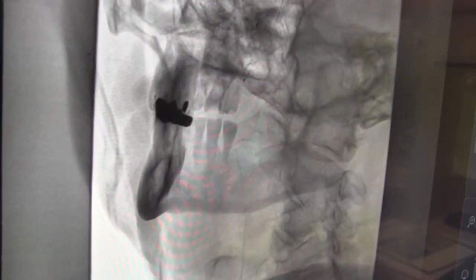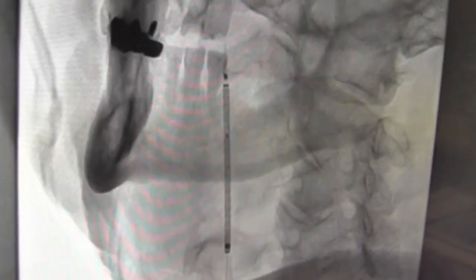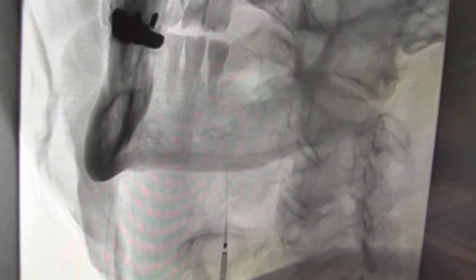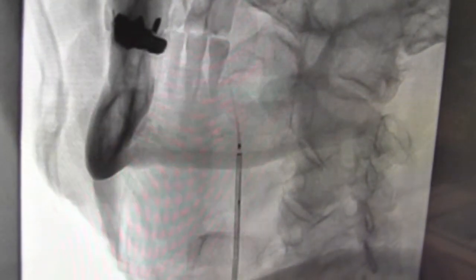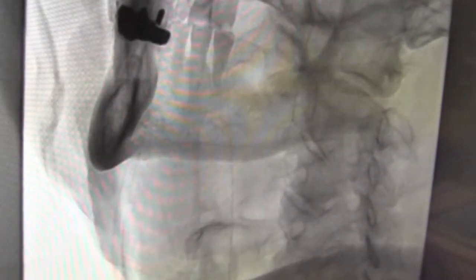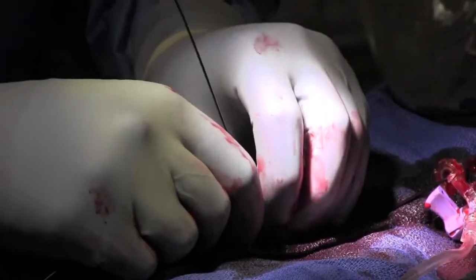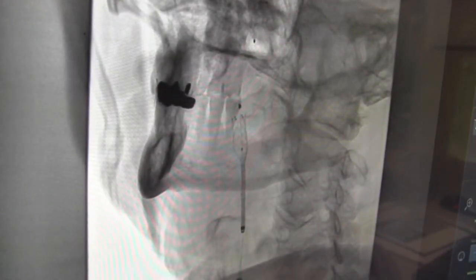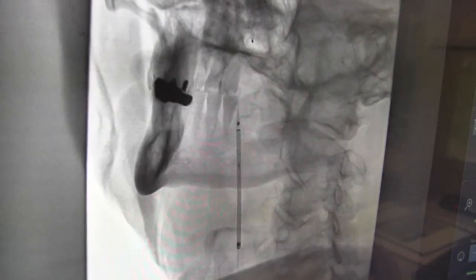We're advancing our self-expanding stents. These are more flexible and made of a material called nitinol, which is a very flexible alloy — necessary because of the twisting and turning in the neck area. We need to use self-expanding stents rather than the standard balloon-expandable stents used in the heart. We're now releasing the self-expanding stent; as we pull back on the catheter, the stent automatically expands up against the wall of the artery.